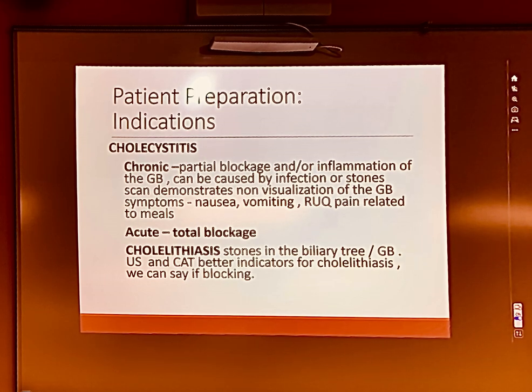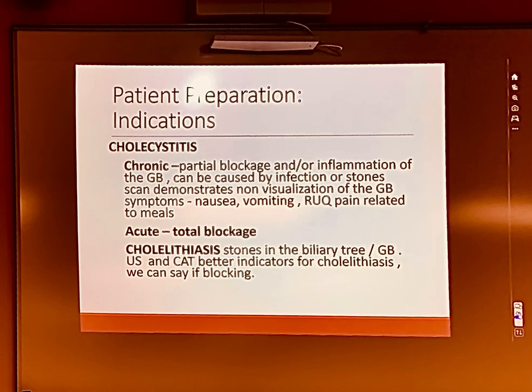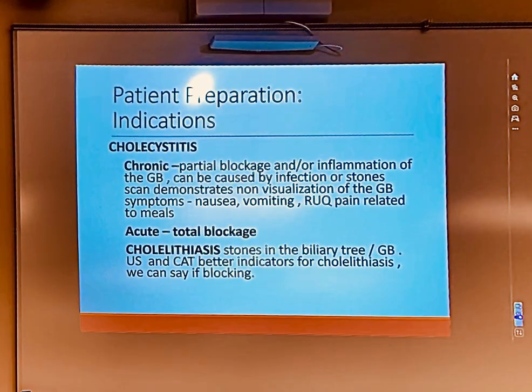So when you have acute cholecystitis, the gallbladder never shows up, because it's so inflamed. It's an acute process. It's an onset right now, and it's very inflamed and not working. So what that looks like on our study is the liver is functioning fine. Your hepatocytes are still processing the bile, taking it into your intrahepatobiliary ducts, and it goes down into the hepatic duct.